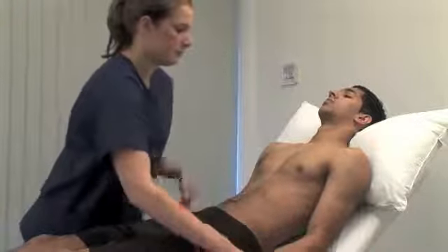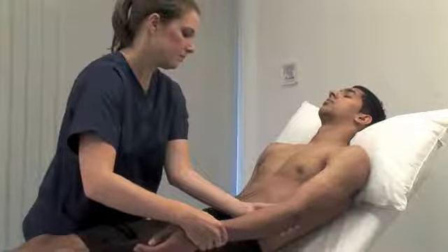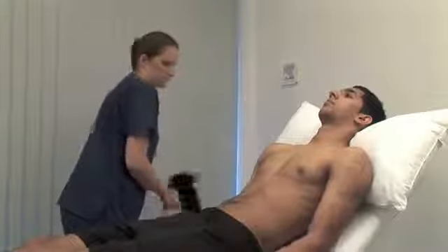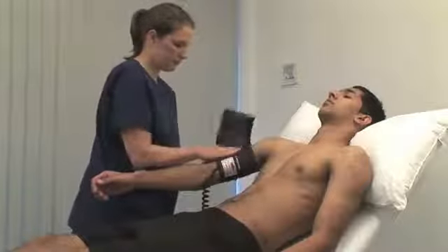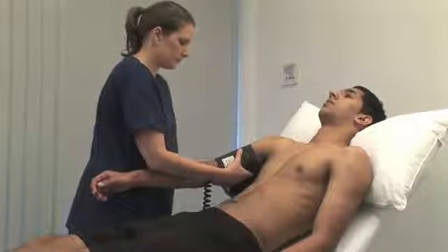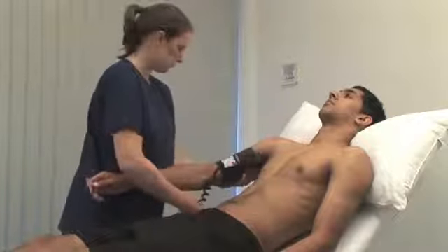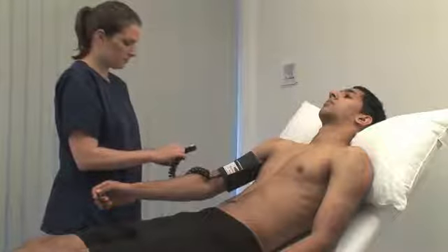To measure the blood pressure, the patient should lie or sit and rest with the arm comfortably supported at about heart level and free of tight clothing. Position an appropriately sized cuff with the centre of the bladder over the brachial artery. Palpate the brachial pulse, which is medial to the biceps tendon, and inflate the cuff.